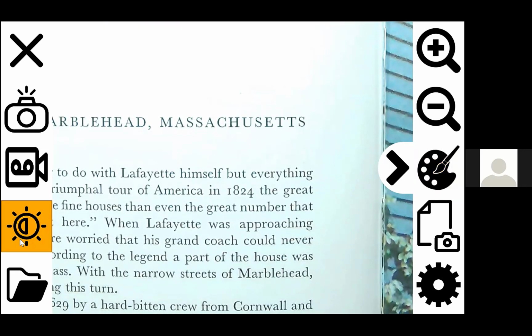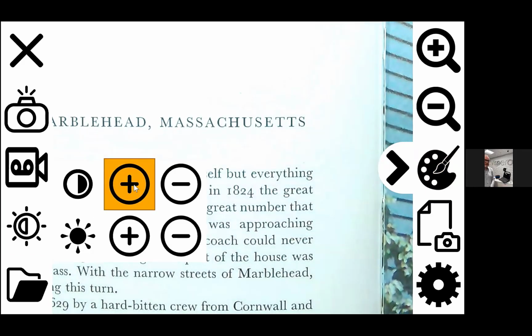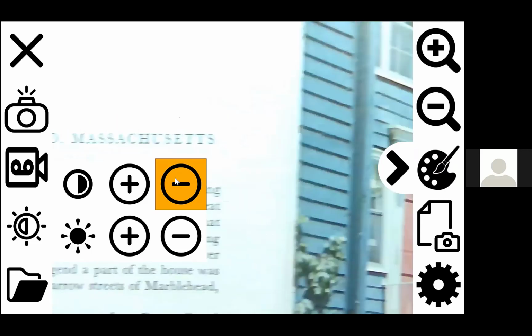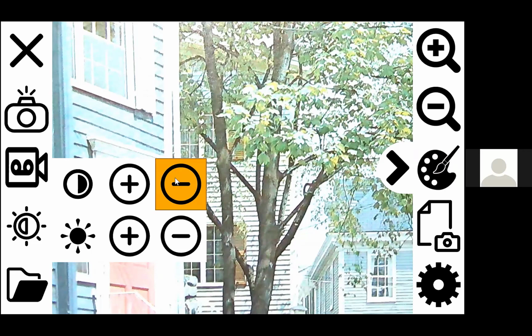Click on that again. It's particularly useful for enhanced color mode, I think. Yeah, and that's where I found the best use of it. So I just switched over to enhanced color mode. Yep. And when you're looking at pictures or photos, I can throw a photo under this actually.